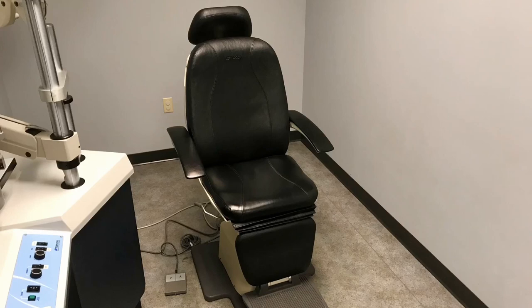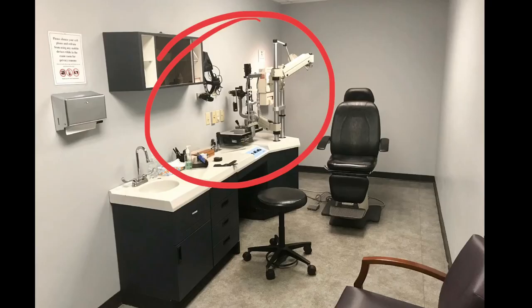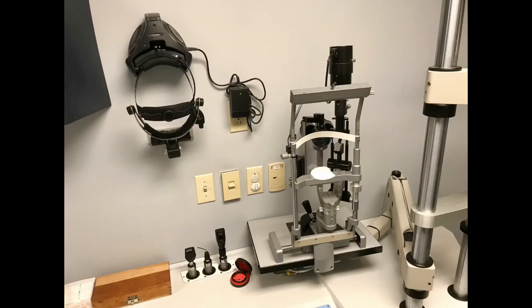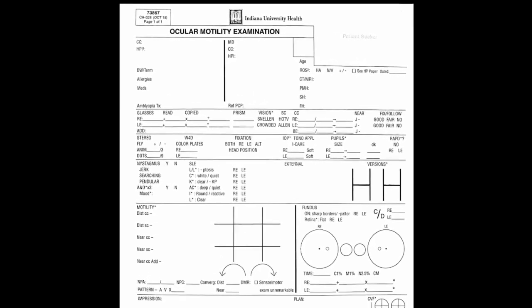A power chair is also particularly helpful for elevating patients up to the appropriate examination height. If a power chair is not available, simply have the child sit on a parent's lap. I find it useful to have all of the equipment within easy reach, consolidated off to one side or the other of the examination chair. To record your examination findings, it is also helpful to have a template which has specific strabismus elements.